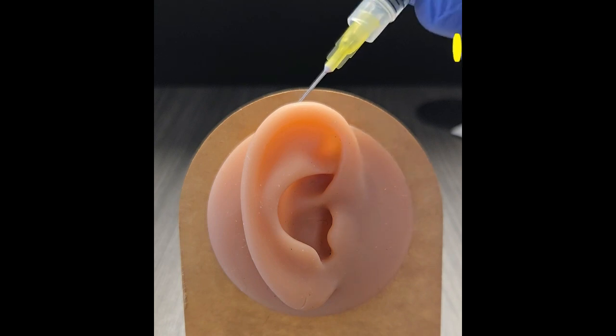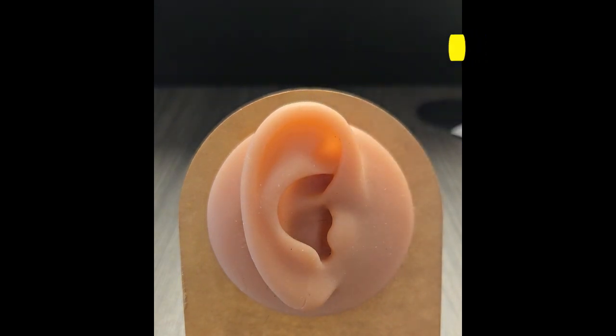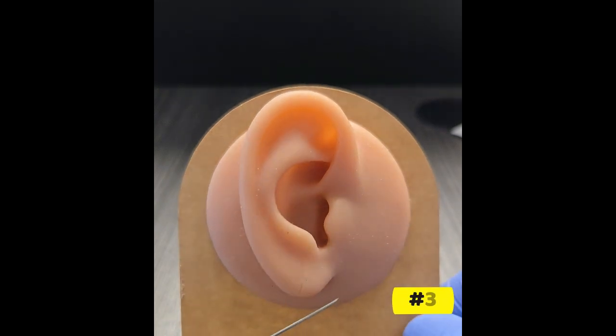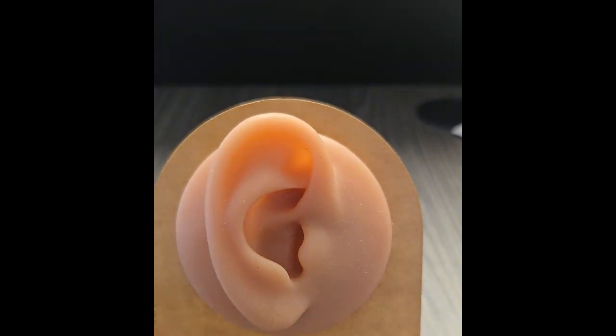Injection number two — and as you notice, this is behind the ear. Injection number three. And finally, to close out my diamond, injection number four.